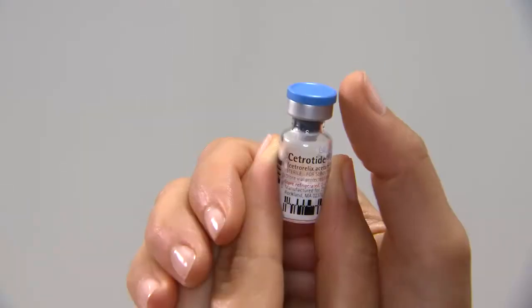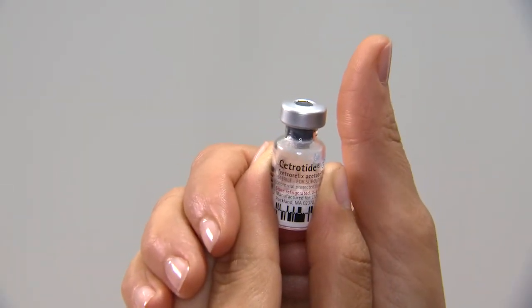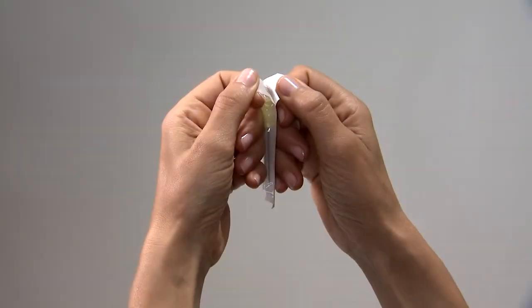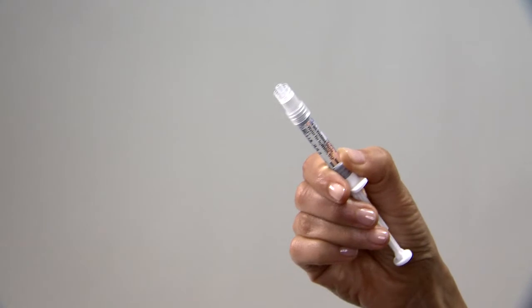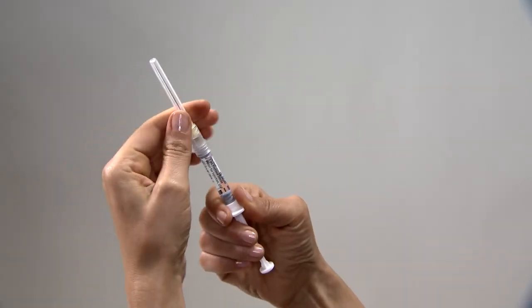Step 1: Mix. Using your thumb, flip off the protective plastic cap on the Cetratide vial. Wipe the top of the vial with an alcohol swab. Remove the wrapping from the yellow mixing needle. Take the pre-filled syringe and remove the cover, then twist the yellow mixing needle onto the syringe and remove the cover of the needle.